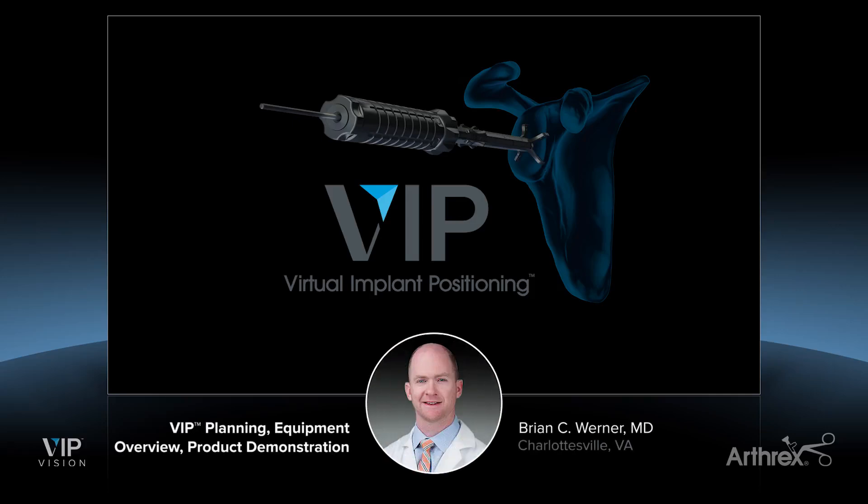I'm Brian Werner from Charlottesville, Virginia, and today I'm going to demonstrate planning a VIP case that we will then use to demonstrate depth of ream instrumentation.